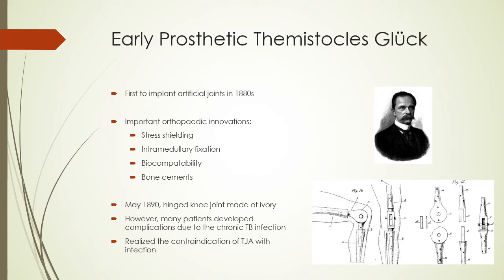As we talked about Dr. Gluck's contribution to hip arthroplasty in the hip section, we want to also point out that Dr. Gluck also contributed to knee replacement as well. He proposed several important orthopedic innovations, such as the concept of stress shielding, intramedullary fixation, biocompatibility, and bone cements.